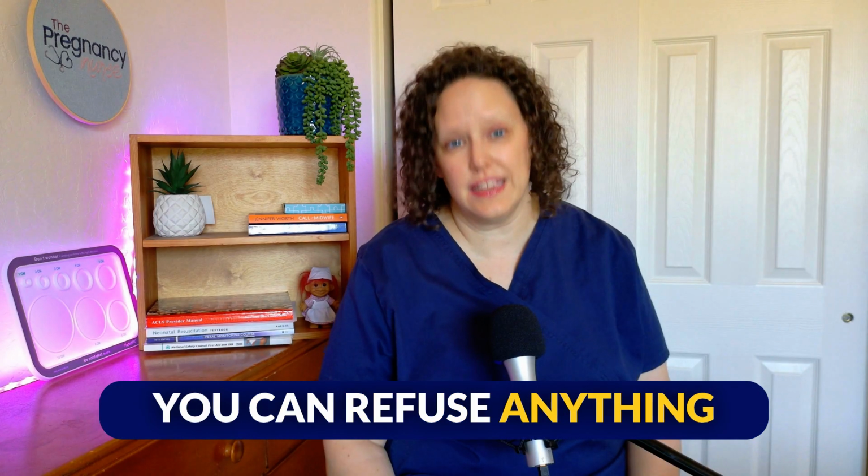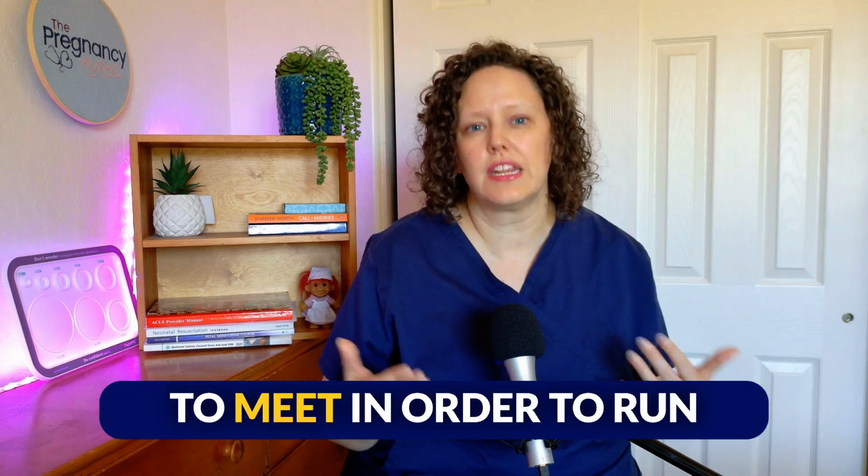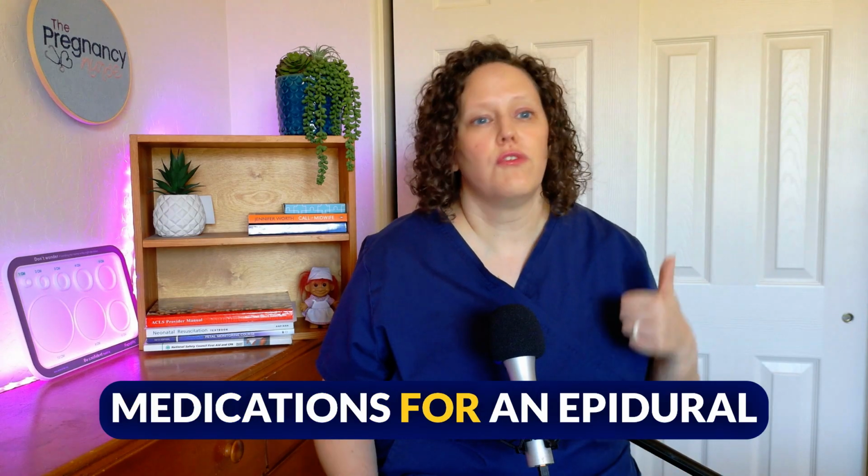Absolutely. You can refuse anything in the hospital, but I'm here to tell you that it is one of the big tools in our toolbox to monitor baby throughout delivery. And if you were to say, I do not want fetal monitoring, we would not be able to induce you, and we would not be able to run an epidural during your labor. As a nurse, there are certain requirements that I have to meet in order to run medications for an epidural or for an induction. So it's important to know that if you were to refuse fetal monitoring, you can't do any of the higher risk things.